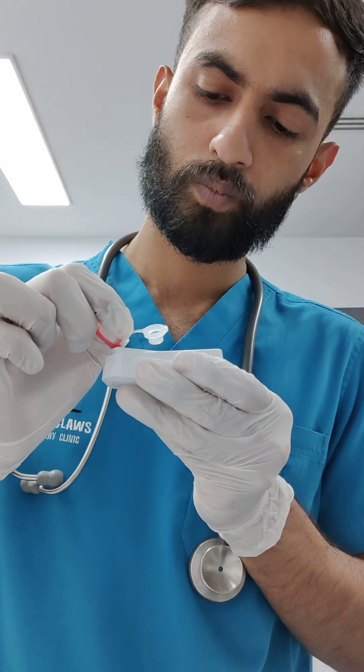Once the sample reaches this point, it means we can put it into the machine to run. I am going to add this sample into the sample well — the whole sample, which is a total of 7 drops: 3 drops of blood and 4 drops of reagent. Now it is inside. I will put it on a very plain surface so it will run smoothly. Once it reaches the dot at the opposite end of the sample well, you can put the sample information into the system, which we are going to show you next.